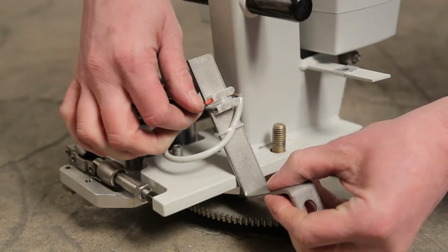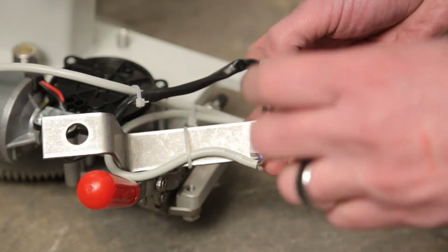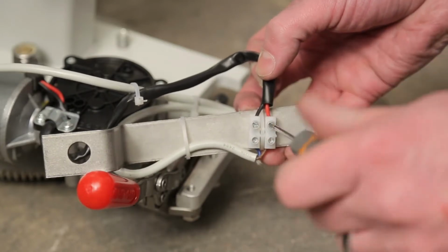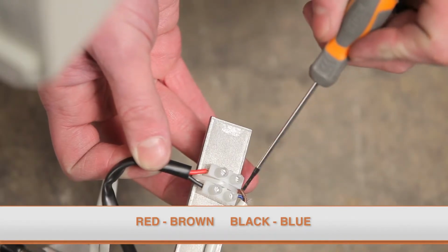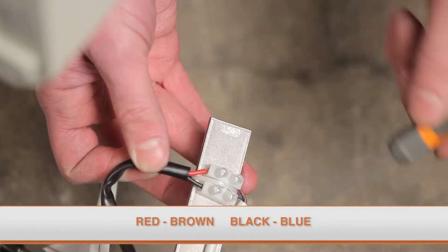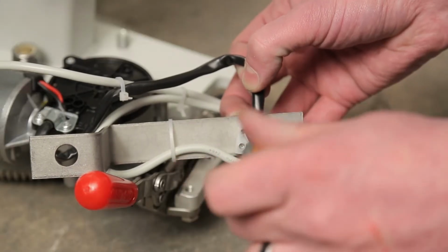Make sure to note the cable routing, as this will need to be repeated when installing the new cable. Connect the end of the cable to the terminal block, making sure that the red wire from the motor is matched to the brown wire from the cable, and the black wire from the motor is matched to the blue wire from the cable. Then securely tighten the terminal screws.